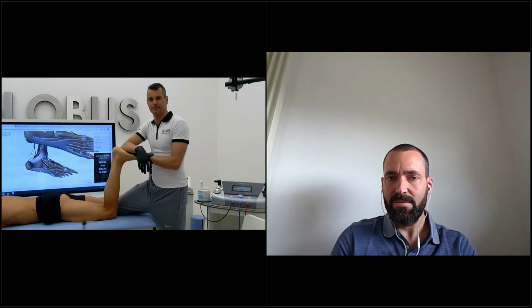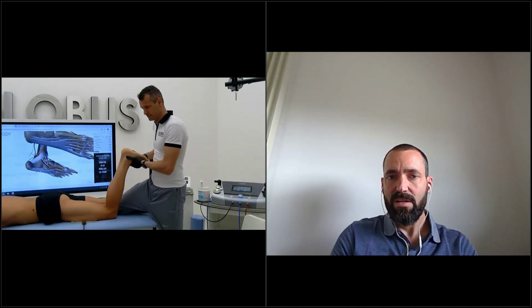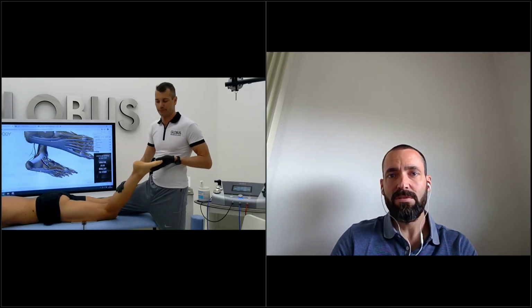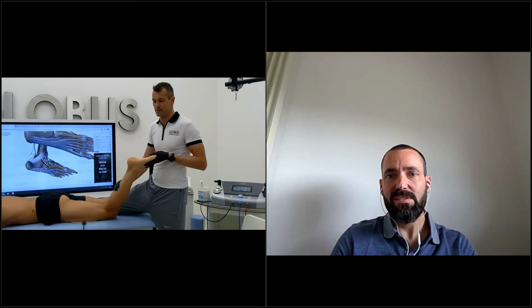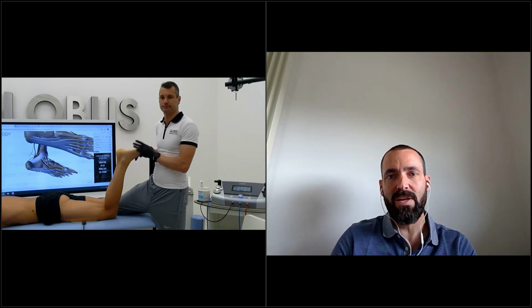So always when you have foot problems, check the mobility of the ankle, and even by treating the calf, the distal part of the calf, you can improve the dorsiflexion of the ankle. For the treatment of all these pathologies, you have to improve the dorsiflexion of the ankle.